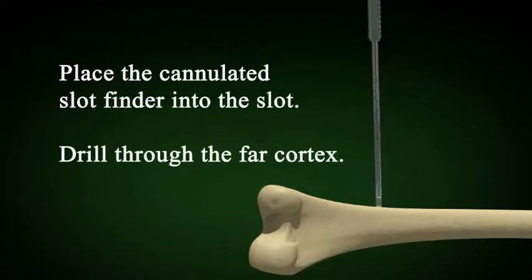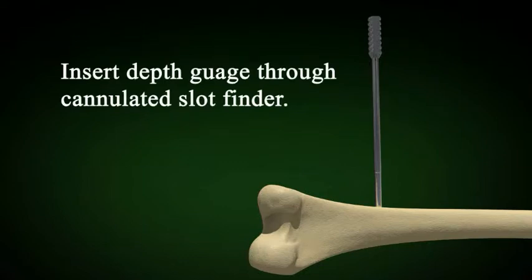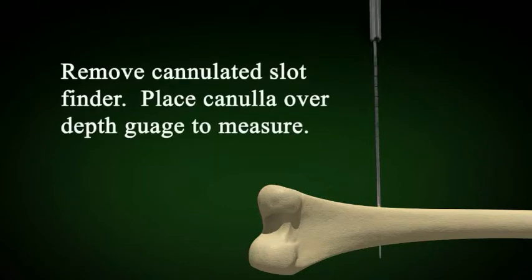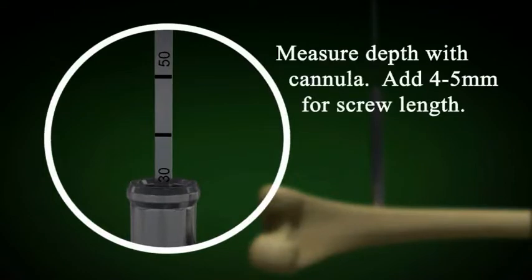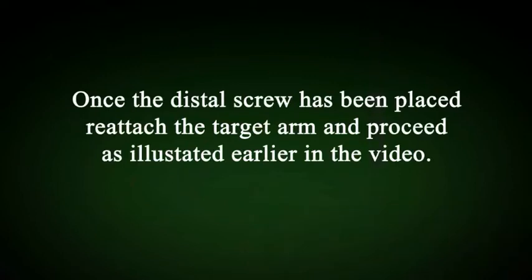Remove the solid slot finder and place the cannulated slot finder into the slot. Insert the depth gauge through the cannulated slot finder. Replace the cannulated slot finder with the cannula. Measure the depth of the screw using the cannula, as noted before. Once the distal screw has been placed, reattach the target arm and proceed as illustrated earlier in the video.